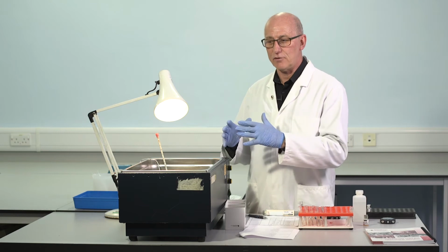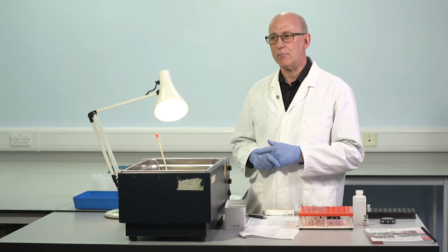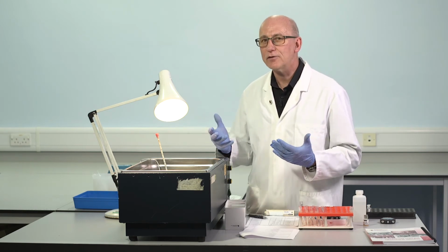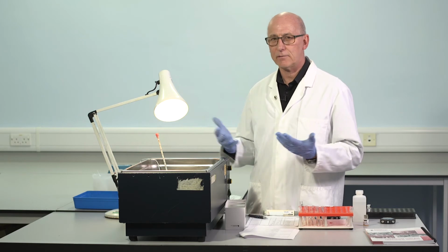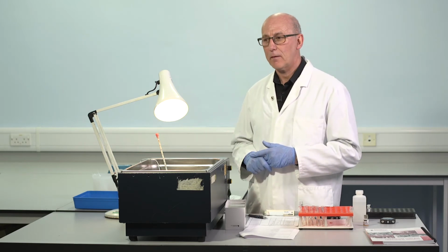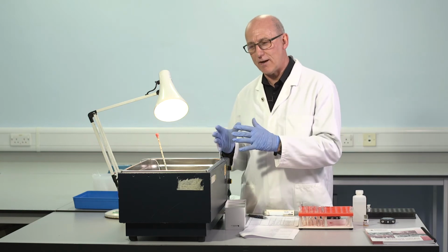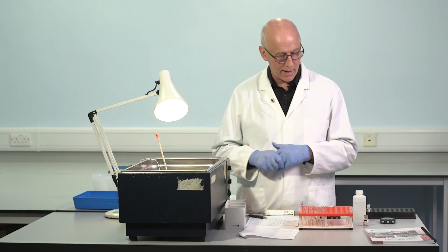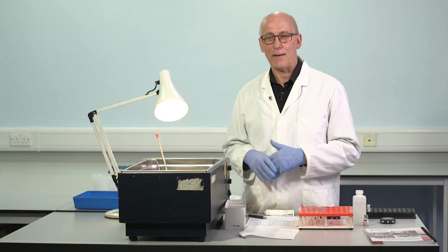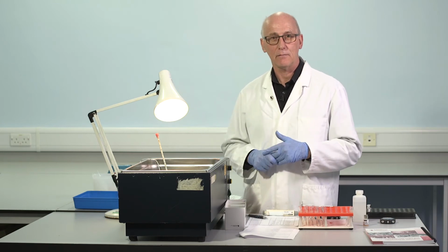We're running these reactions here in a very artificial way. Remember, in the APTT reagent, we're activating with kaolin or celite. These are not physiological activators. Kaolin, clay particles, celite, effectively sand, ellagic acid, not physiological activators. We're running these reactions very quickly in a very artificial way, and under those conditions, we obtain clotting times, even in the absence of factor VIII, so a severe haemophiliac APTT.